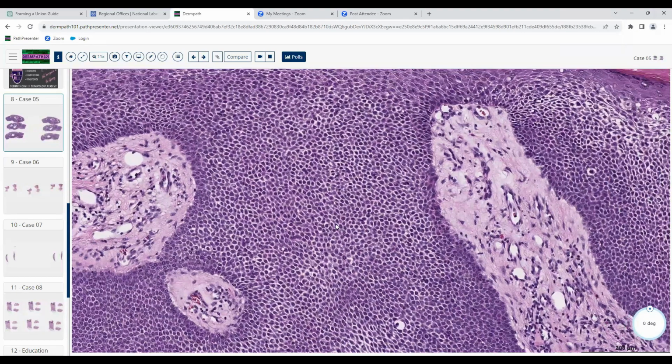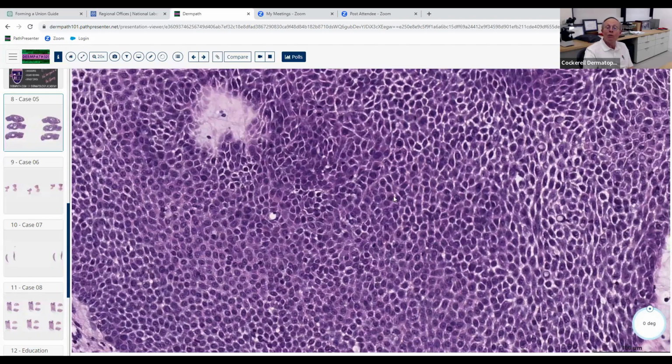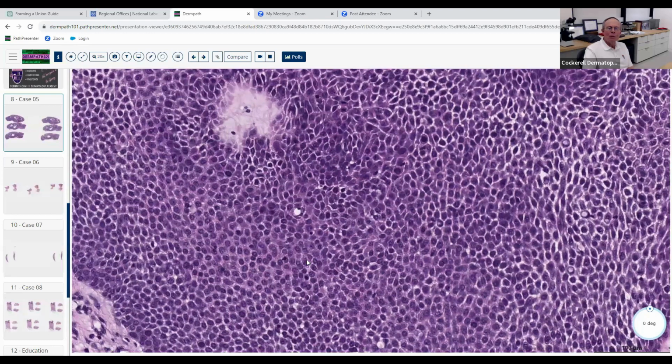Other area. What about if you just look at the individual cells themselves? Describe those cells. Well, they have dark blue nucleus. There's a relatively high nucleus to cytoplasm ratio. I don't see a lot of pleomorphism. I agree. So no cytologic features that make us think it's malignant. What about if you look at one compared to another? How some are darker and some are lighter in color, maybe. A little bit, but do they look pretty similar?